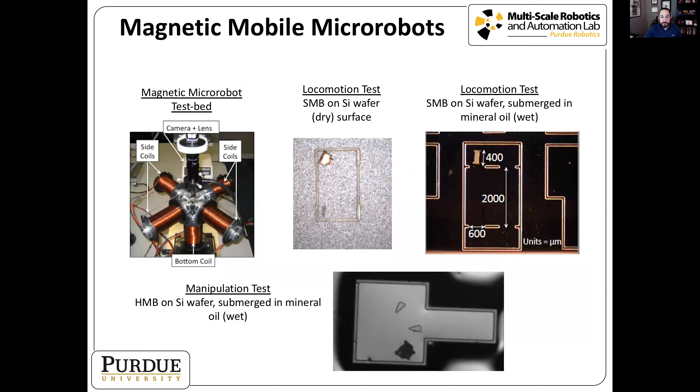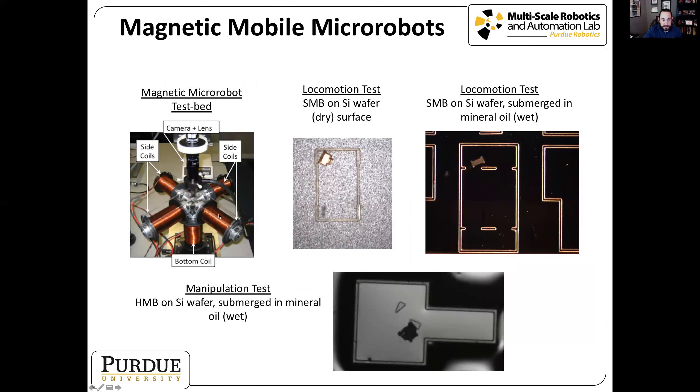To test these robots, we developed an electromagnetic coil system — coils surrounding the workspace where we can control current values to control the magnetic field. The first example shows a soft magnetic body on a silicon wafer on a dry surface. The dry surface has very high friction that must be broken for the robot to move, requiring very high currents through the coils, causing the robot to move fast and uncontrolled.